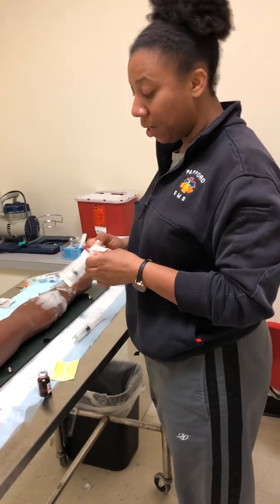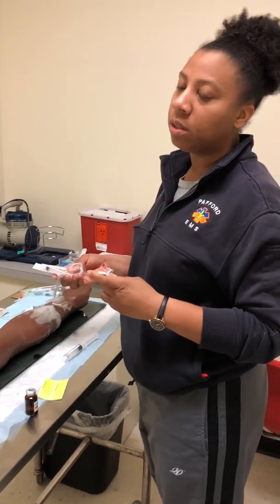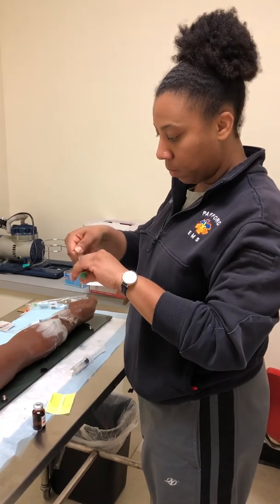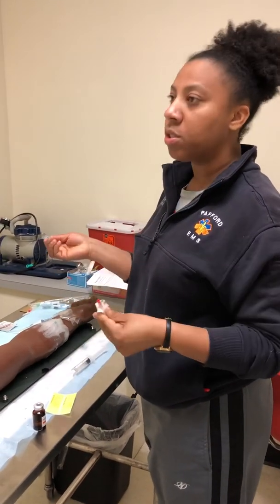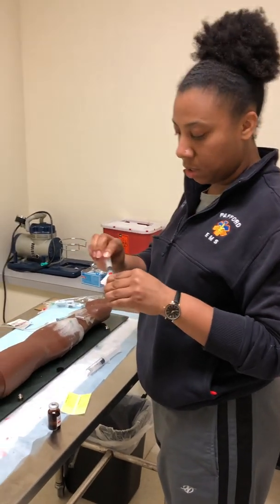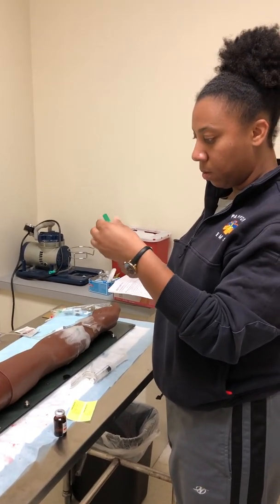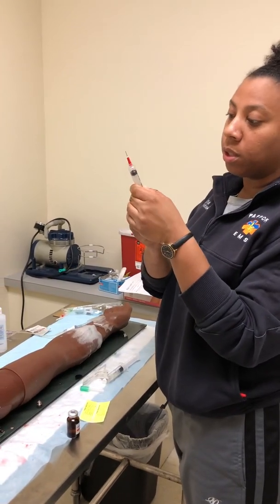At this time again, even though I haven't given the patient medicine, I would ask again about allergies. Take this off. Since it's 4 milliliters, I would need at least a 5 milliliter syringe. Okay. All right, I'm going to draw up 4 milliliters of air.